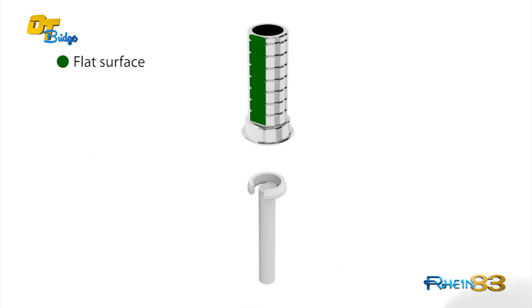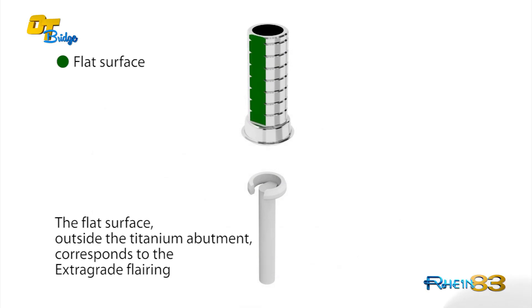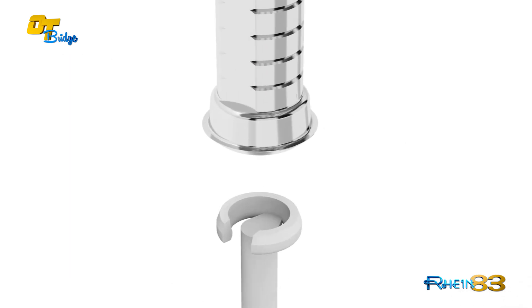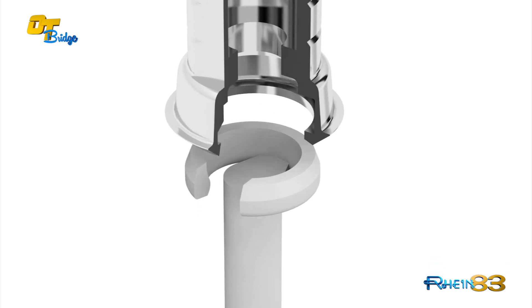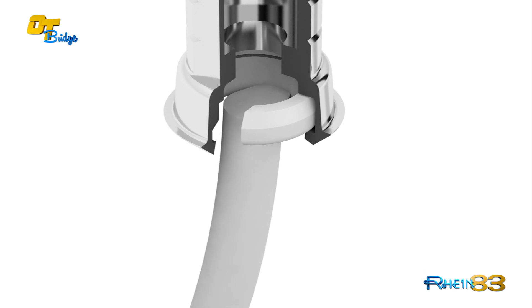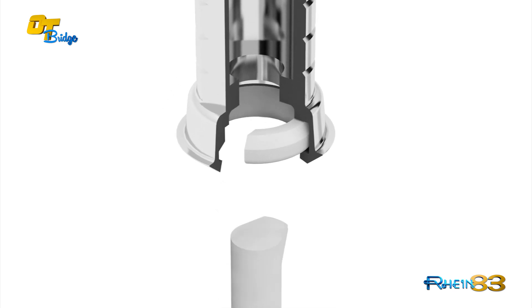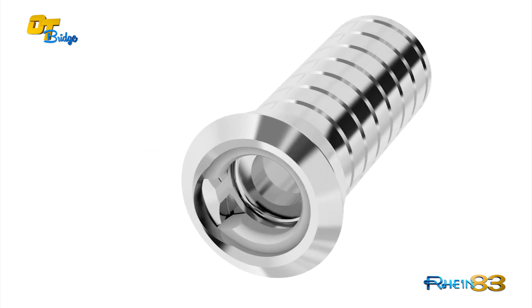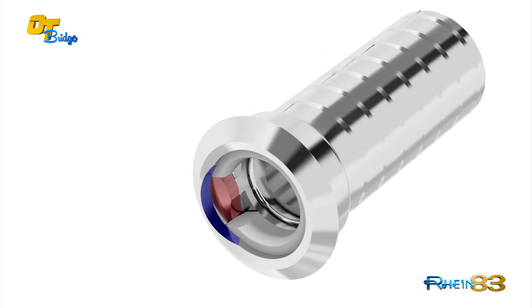The extra-grade titanium abutments, compared to the temporary one, have a specific position in relation to the plastic sega ring. It is important to note the sega ring must be placed with the open side in alignment with the flat surface of the extra-grade titanium abutment. A non-rotating device, here marked in red colour, does not allow rotation of the sega ring.